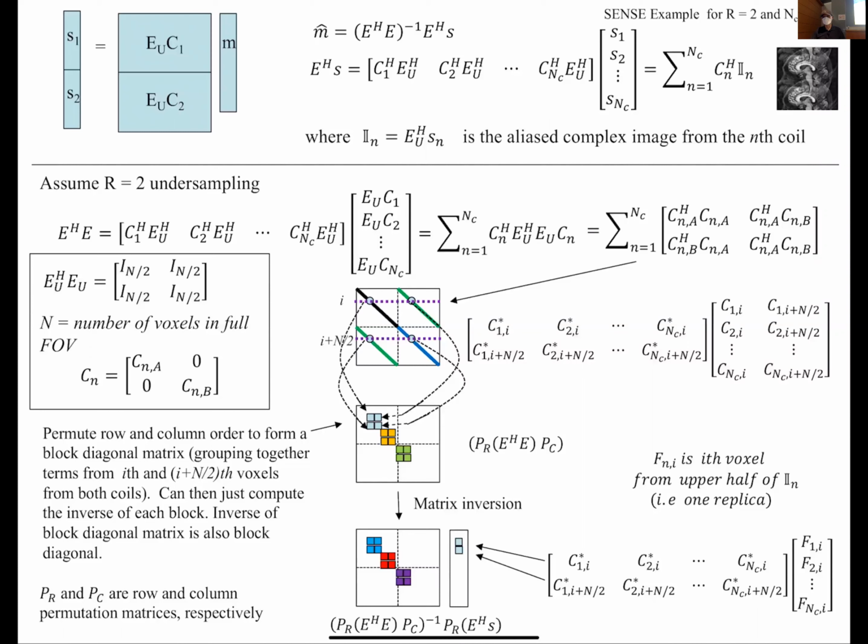Now, the next thing we want to talk about is what happens with these coils. If you want to do this, what should be the optimal coil profile you want? Okay. So we said before, if you're doing overdetermined, then the sum of squares works really well. These coil profiles are changing relatively slowly, so the coils have a lot of overlap. But if the coils didn't overlap so much, then that was not so good for a sum of squares.